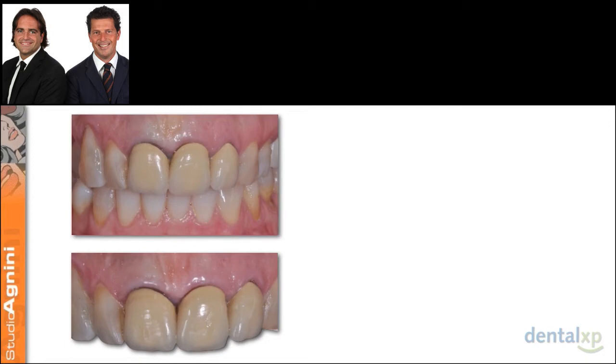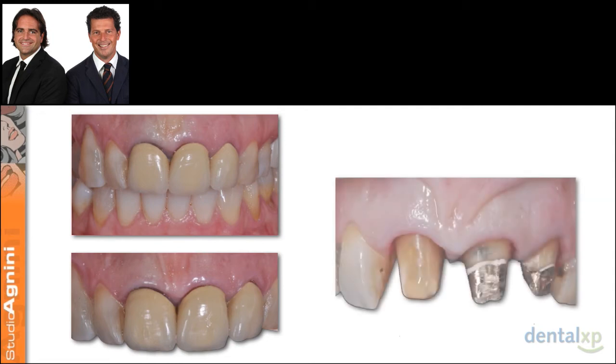And of course, the first thing that has to be done is to take out these crowns and reprep the teeth in order to eliminate again all the undercuts, change the finishing line, passing from a horizontal finishing line to a vertical finishing line, because we want to be more conservative and we want to preserve as much dental structure as possible. Then we place the temp.